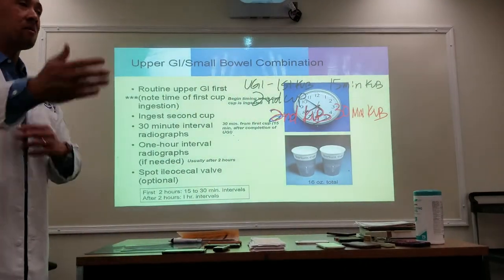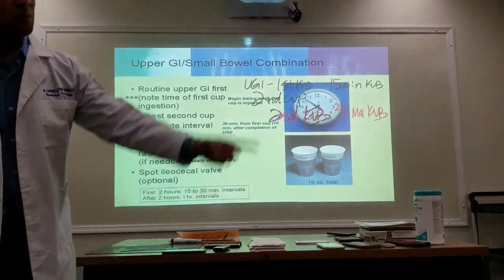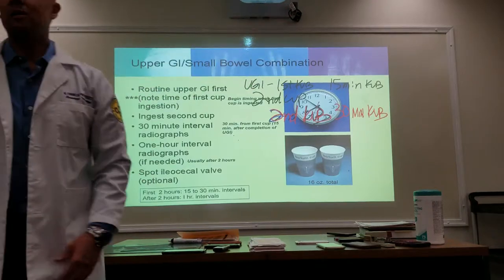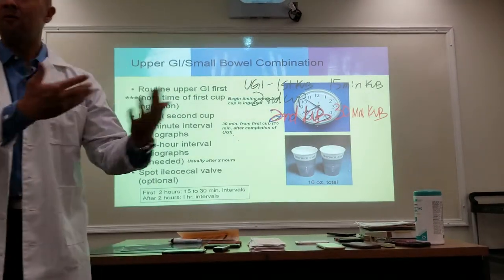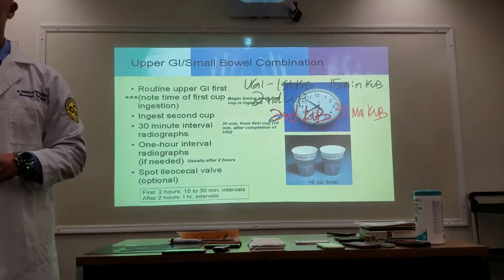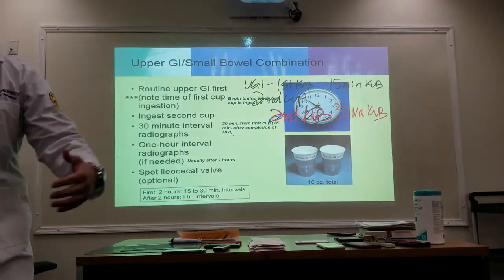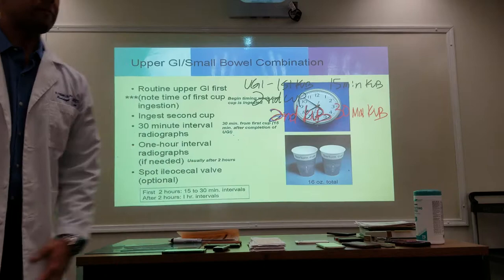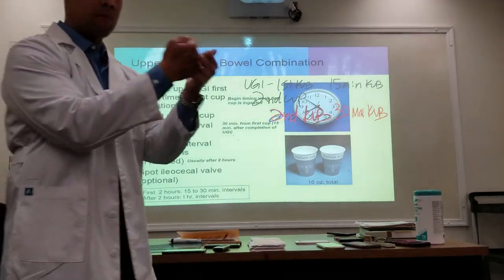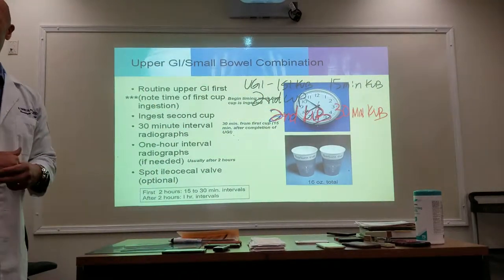When you bring them into the hallway, you're going to tell them their parameters. You know, Mrs. Jones, just walk all the way down to that second bathroom, don't go past that, and then just walk back. I want to be able to find you, so that when we take our next shot, I can easily grab you and pull you into the room, but I want you to keep in sight. So go that far, and go that far, that's your parameters. That's why we say bring something to read. They're going to be looking at their magazine or playing on their phone, but we need to keep them busy in between the shots.